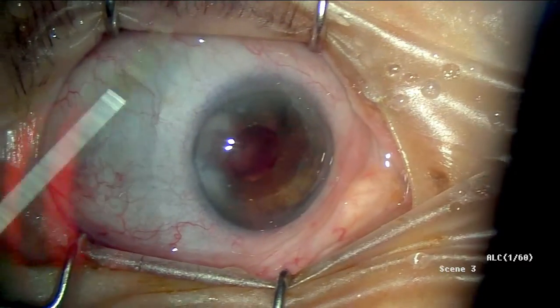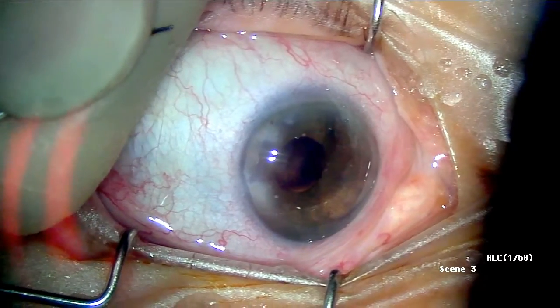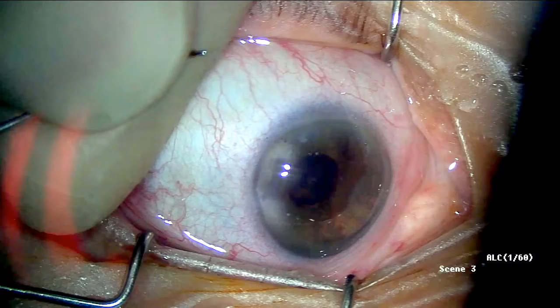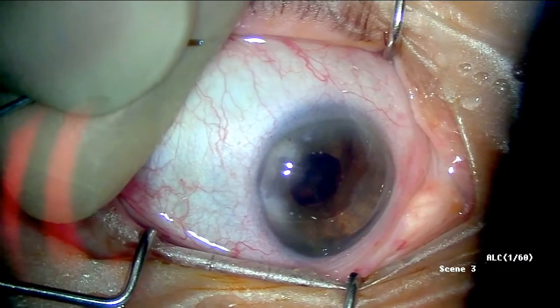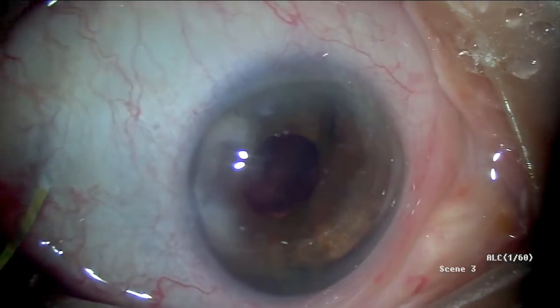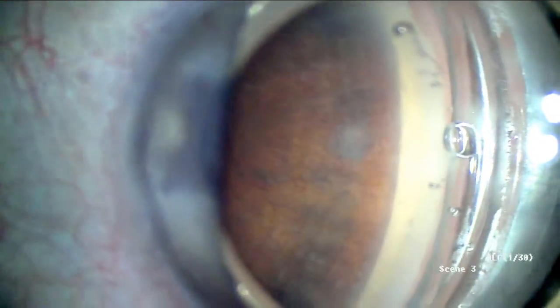The pupil is already pharmacologically constricted with Miochol, and the anterior chamber is filled with viscoelastic. The stent is moved down towards the very tip of the guide wire. The scope and the patient's head are angled to 45 degrees in order to optimize angle visualization. The gonio lens is applied.